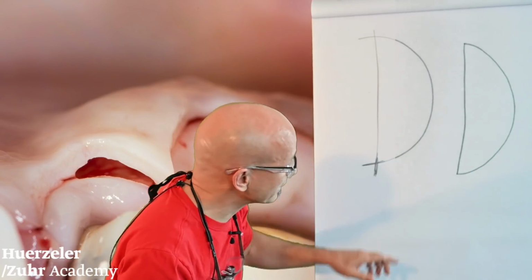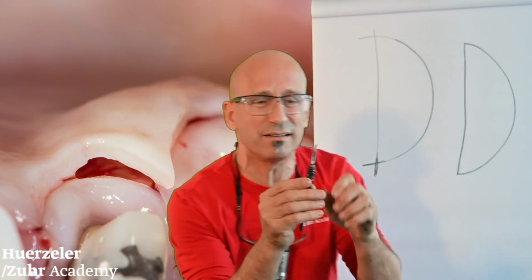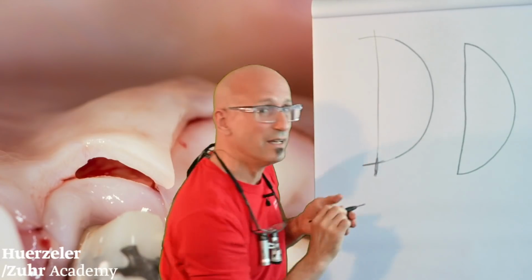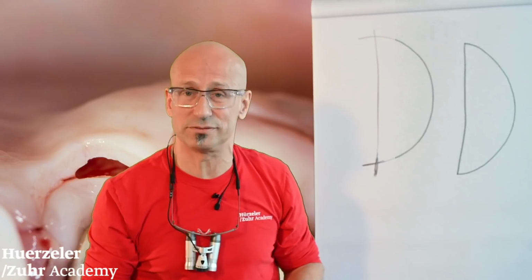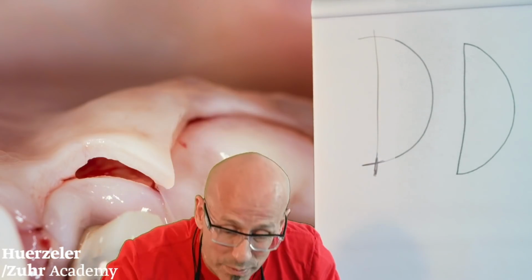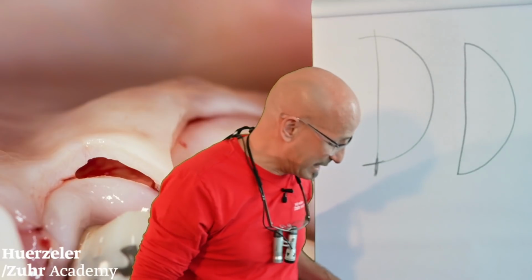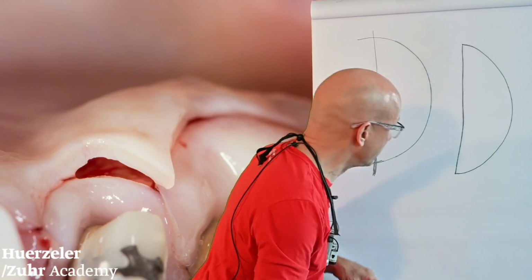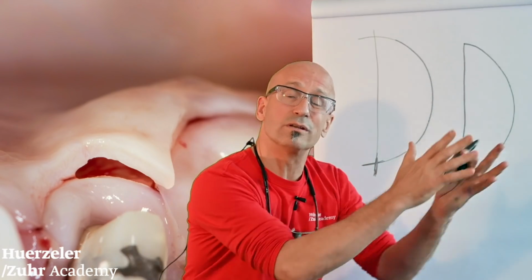If you do the cut with a round blade, remember, this is the round blade we use, and we cut like this perfectly, in the deepness we do not cut thick enough. We don't cut completely through in the deepness, and this is a big problem. This then creates, at the end, in this area here, a thinned out flap.